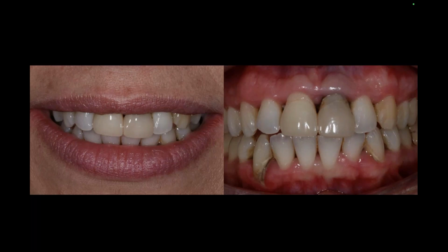So you'll notice this tooth right here, you'll see how dark it is, right? So right away you should kind of get the path that, go ahead. Sorry, I'm in the office and somebody had to come in. Right away you'll notice that there's a little path that's going to be a problem here to mask this dark color. So you're kind of thinking right away, what am I going to do about that, right?